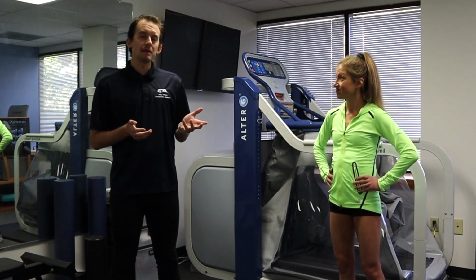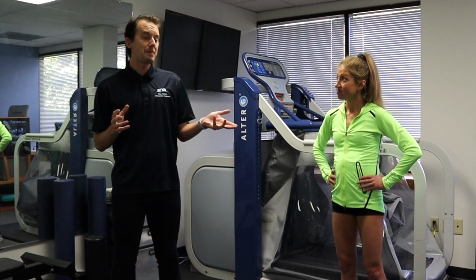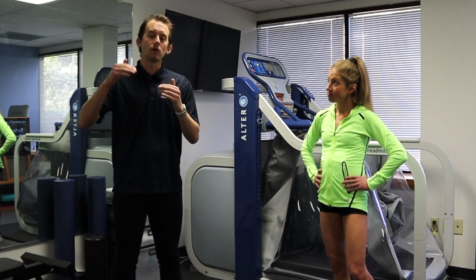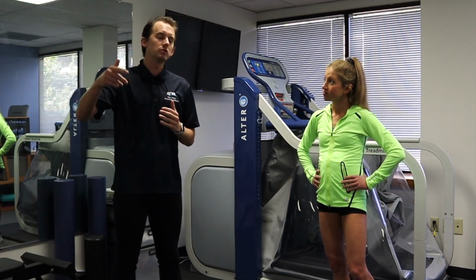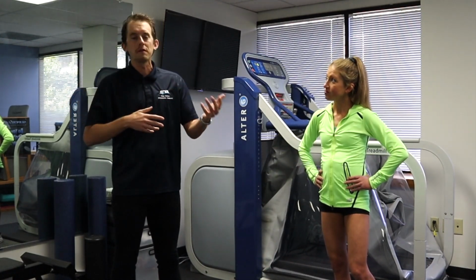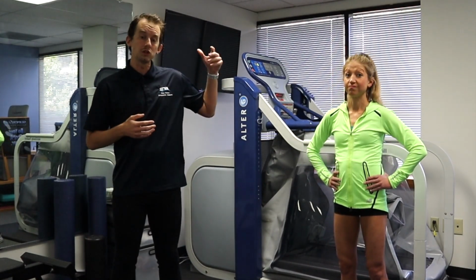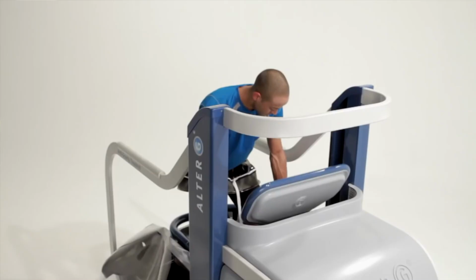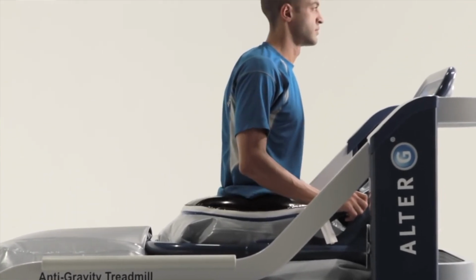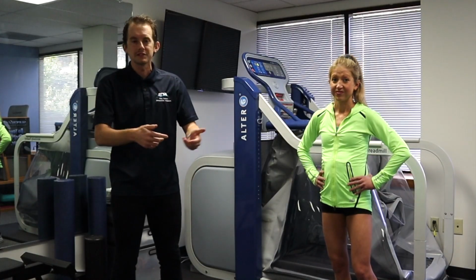Mm-hmm. And at the same time, something like aqua jogging and pool running, although it does have a lot of benefit, the impact never changes with that. So with the AlterG, each time someone's on, we're easily able to increase it 2, 5, 7%. And then over a course of a month or 5 weeks, someone's not only built their bone to be stronger than it was pre-injury, but also you're still running. So your fitness is still the same. It's not like you've been sitting on the couch for 6 to 8 weeks and then suddenly you have to go out and start running, and it's like being a new runner.